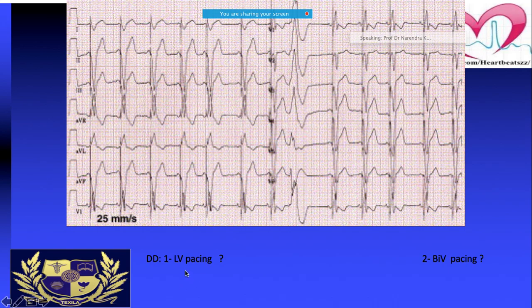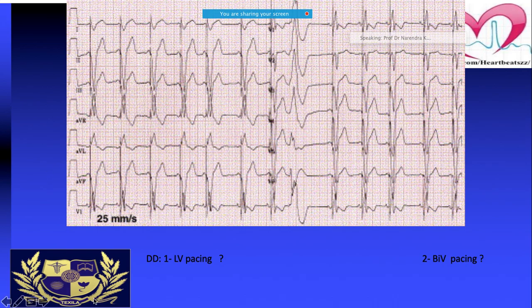The confusion is: is it LV-only pacing or is it biventricular pacing? How will you say? The ECG during biventricular pacing with the RV lead at the apex shows a dominant R in V1 and a right superior axis in the frontal plane, and the QRS complex is relatively more narrow.